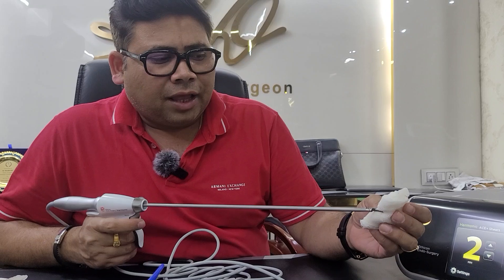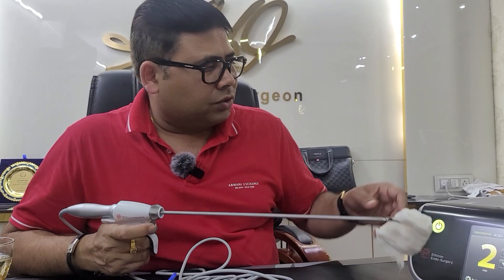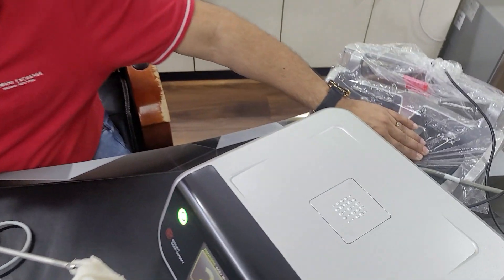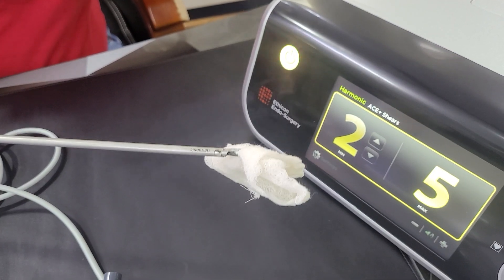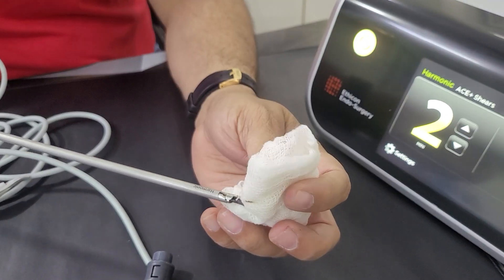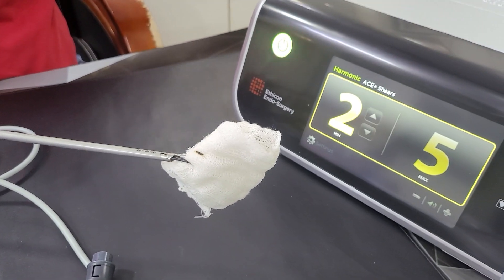Let me show you how this works. This is the instrument — I have just got the tissue. I can use this machine now. I am pressing the maximum — can you see this is working here. When I press the minimum, the sound is different, and this is how the tissue is cooked.